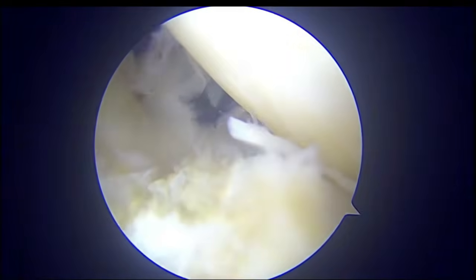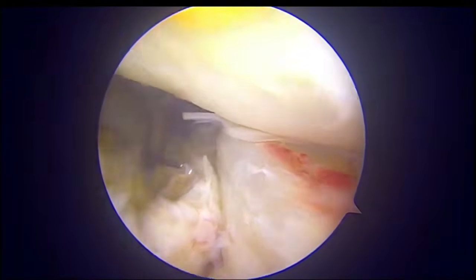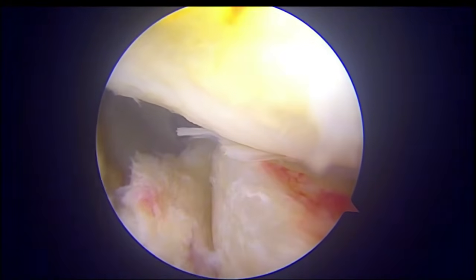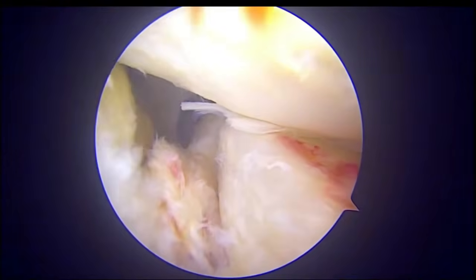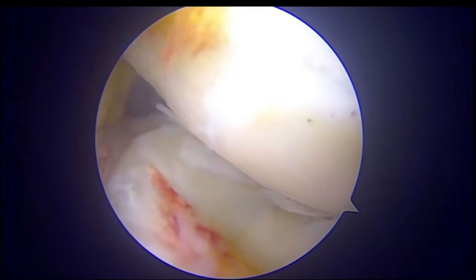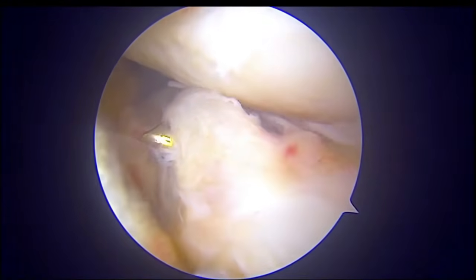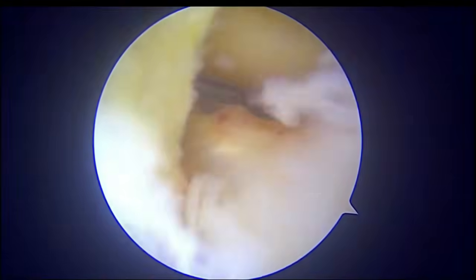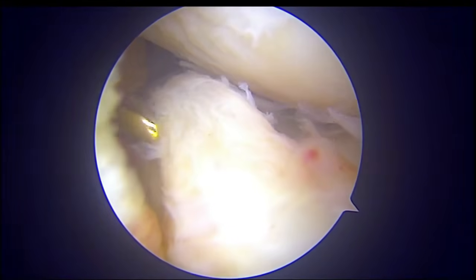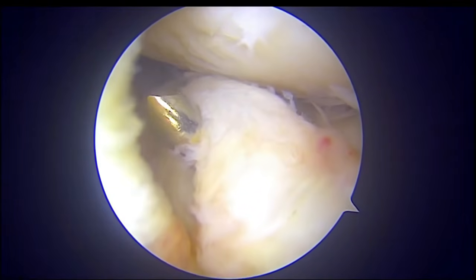And again the lasso is coming for the second suture. This time I got both the limbs of the meniscus with the pass of the lasso. And here I am pushing the nitinol wire.